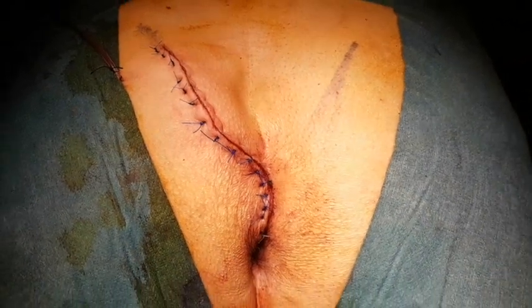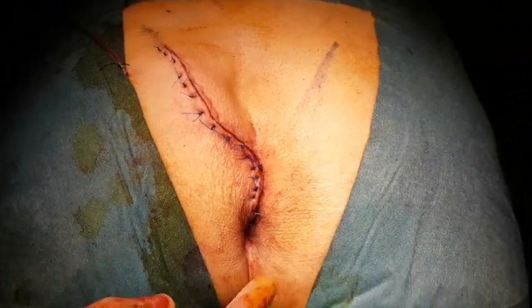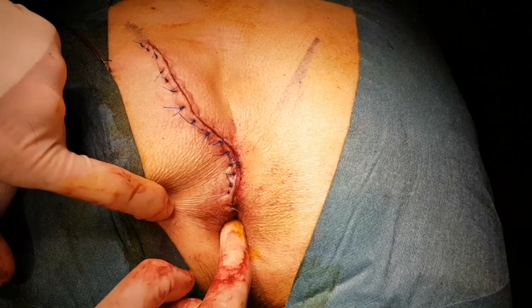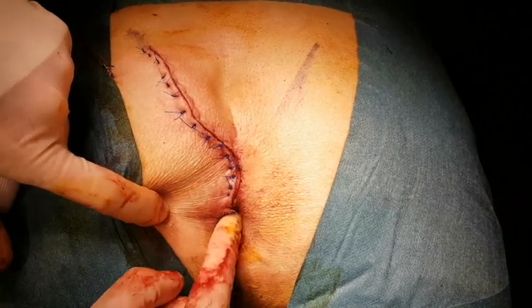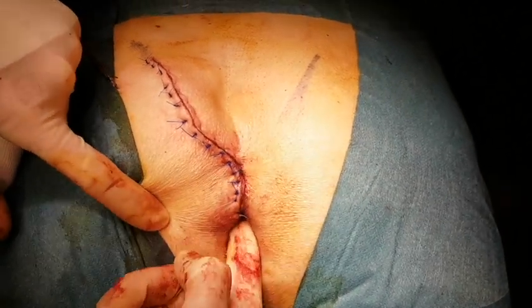A drain is left in place. The subcutaneous tissues are closed with absorbable suture and the skin is closed with non-absorbable monofilament stitches.